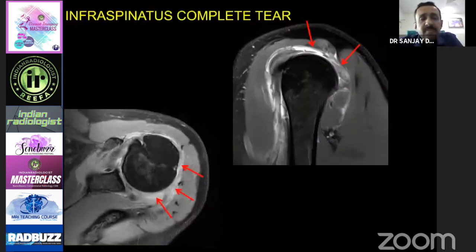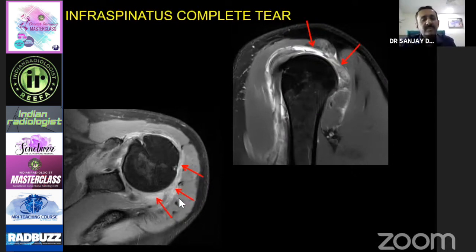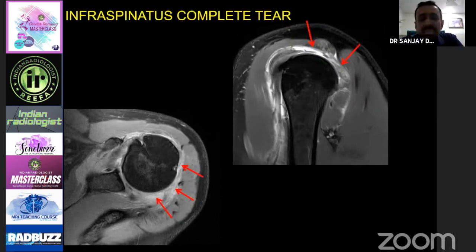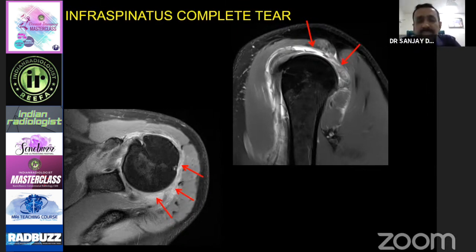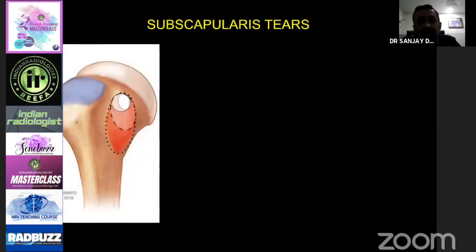Similar to the supraspinatus, you have partial thickness and full thickness tears in the infraspinatus, subscapularis, and the rest of the tendons. Whenever there is a tear, you should measure it from anterior to posterior. For partial thickness tears, measure the percentage of thickness involved — whether it is 50%, 30%, more than 70%, or near full thickness. In this patient you can see full thickness tear of the infraspinatus tendon with retraction up to the glenohumeral joint.